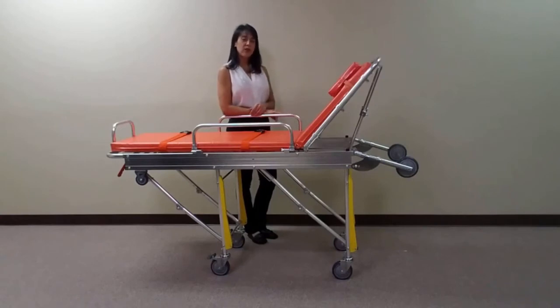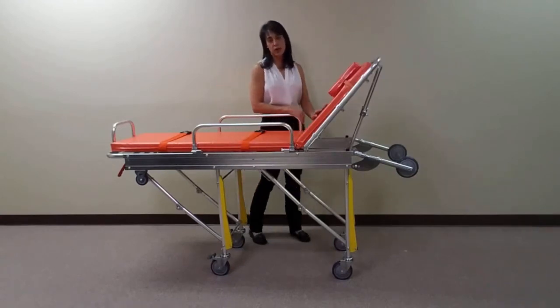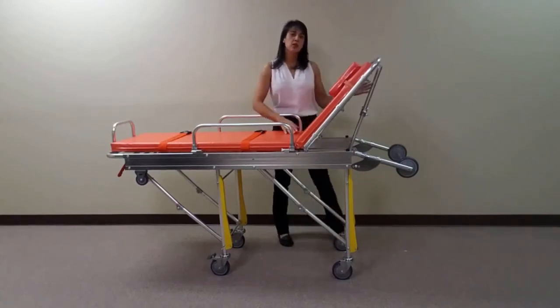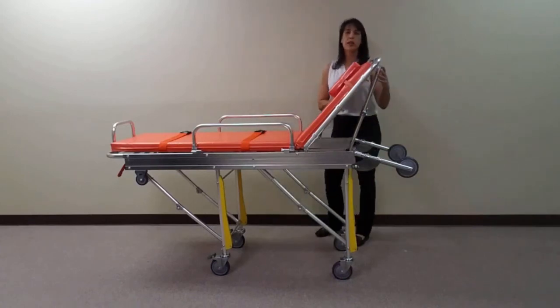To allow for comfort in transit, this stretcher is equipped with an adjustable headrest. The 2-inch fluid-resistant pad is durable and easy to clean. To adjust the backrest, squeeze the red lever located behind the backrest and lift and lower to the desired height.